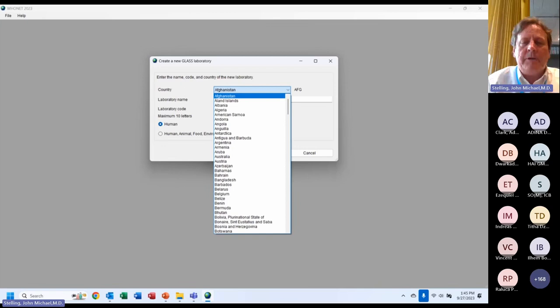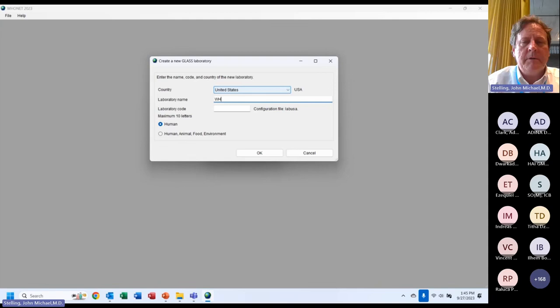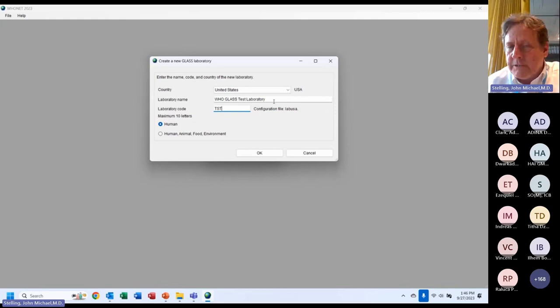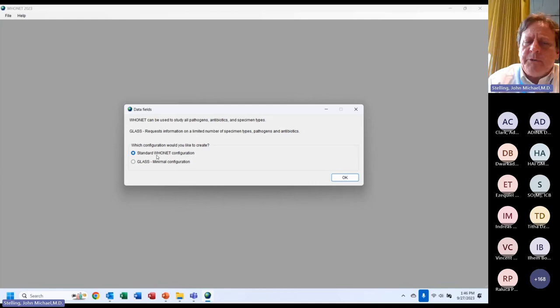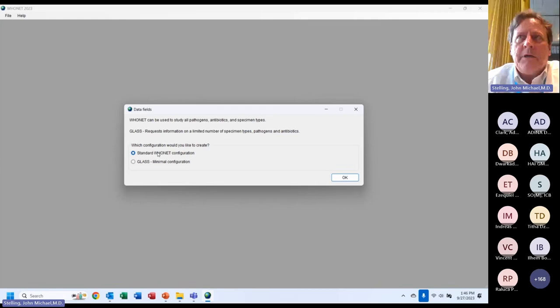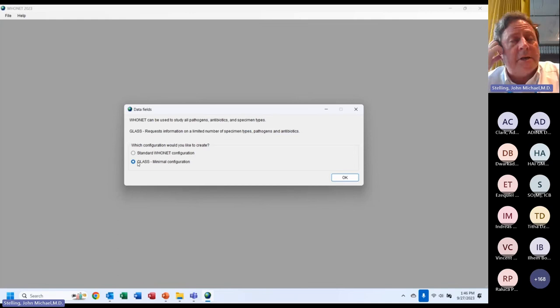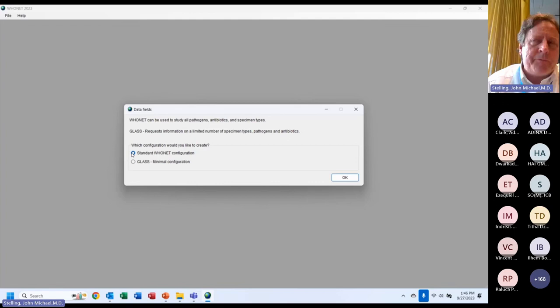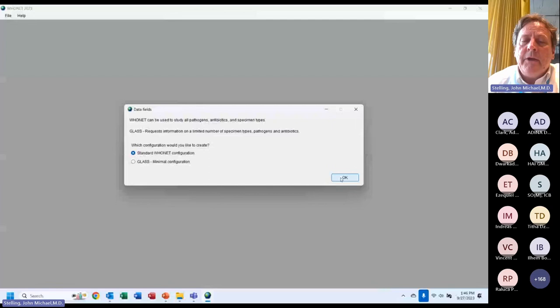I'll create a new GLASS AMR lab called 'US WHO Net GLASS Test Laboratory.' You're asked if you want a standard WHO Net configuration, which I recommend. The standard configuration includes first name, last name, date of birth, department, patient department, and patient location. GLASS doesn't care about first name, last name, or date of birth, so if your interest is purely minimalistic, you can choose the GLASS option. But most people are not doing this only for GLASS — they're doing it for local and national purposes — so most would select the standard configuration.